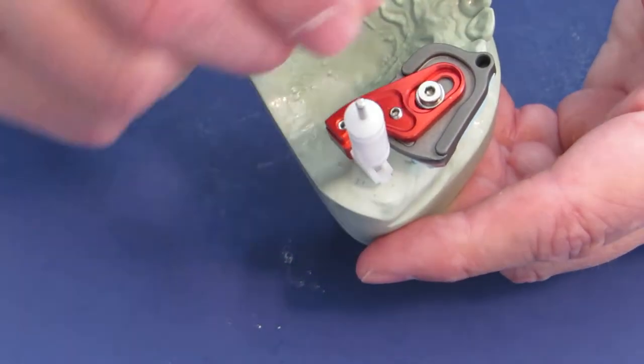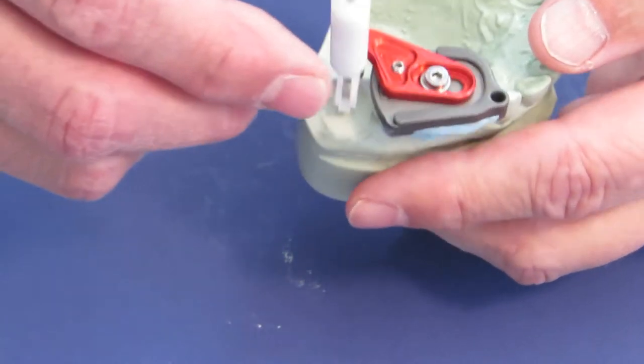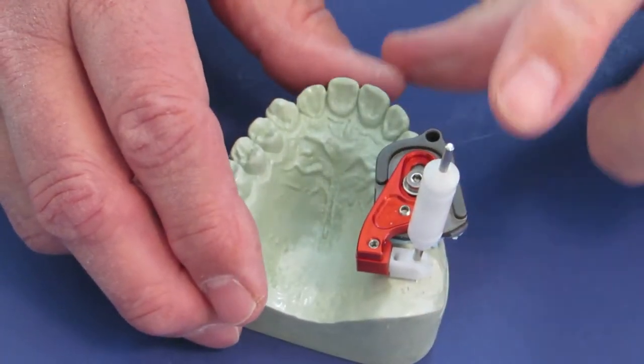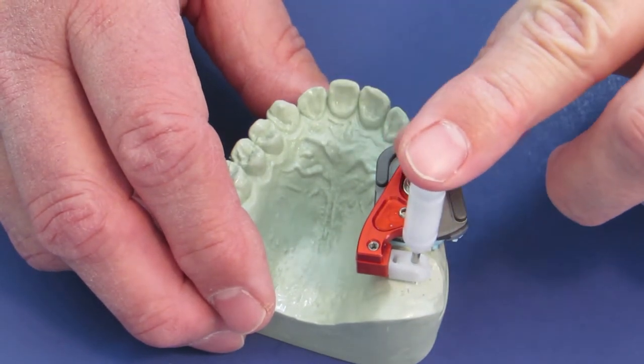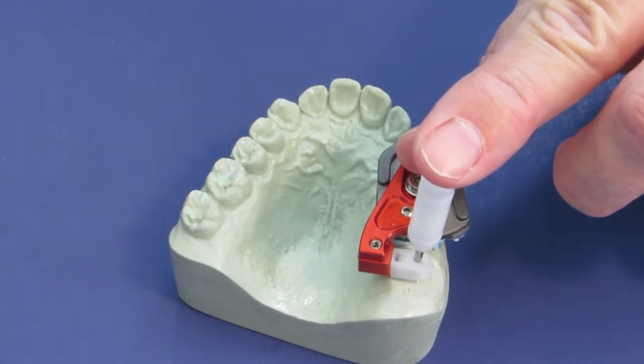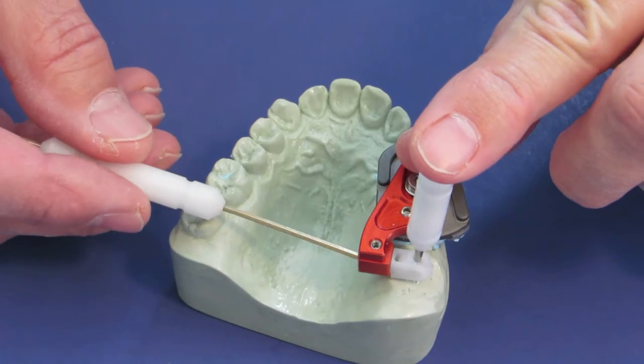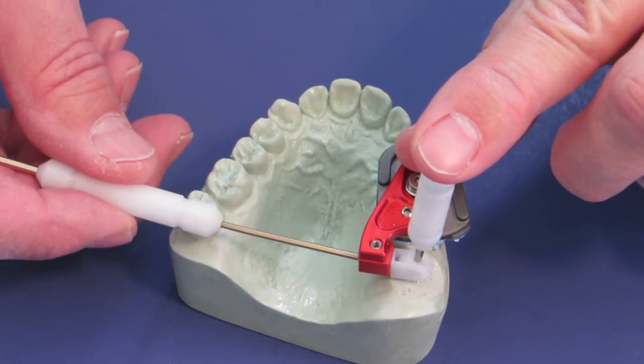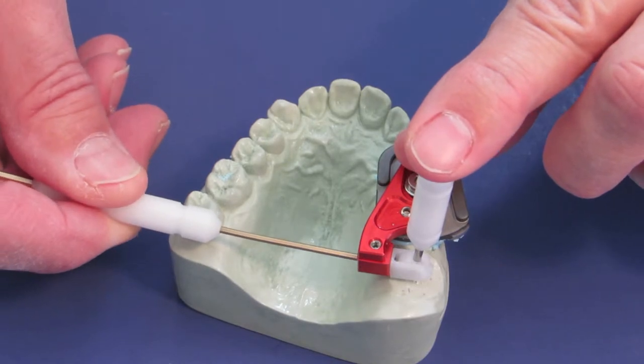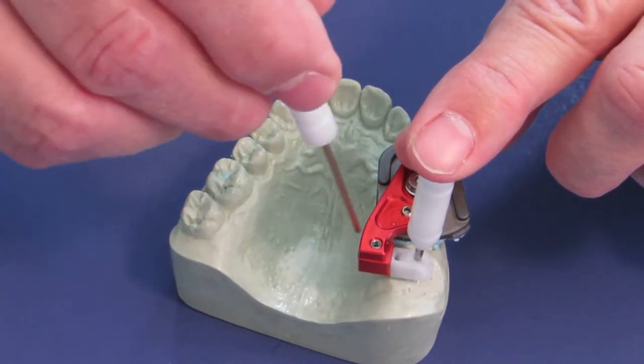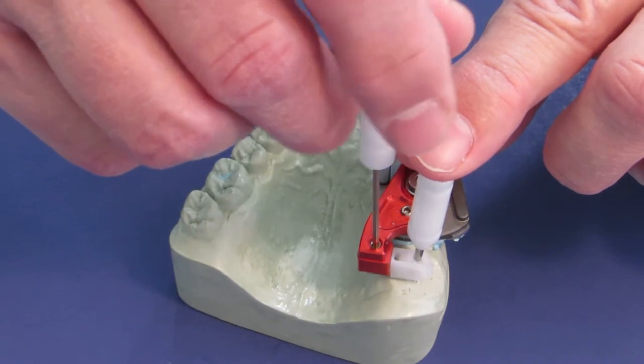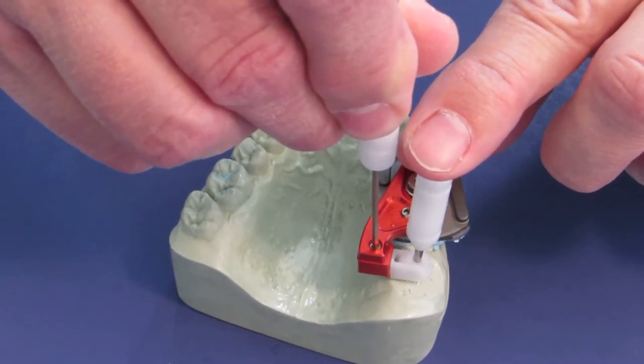Now as I need to move mesial-distal or buccal-lingual, I just line it up when it is in the position that I desire. Then I am going to come into this screw, I twist it until I feel contact and then a quarter of a turn past that. Then I come up to my last adjusting screw, close it until I feel contact and a quarter of a turn.